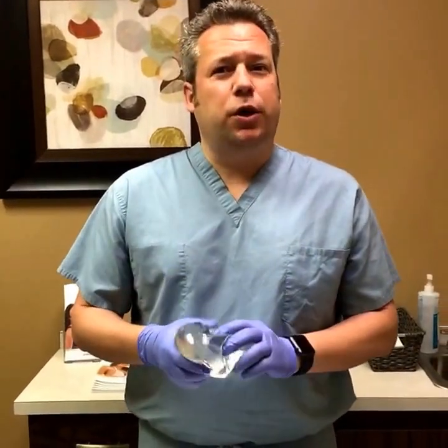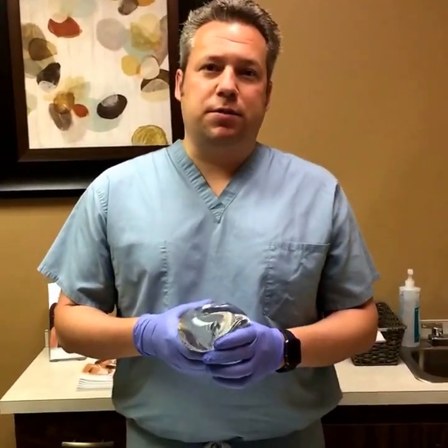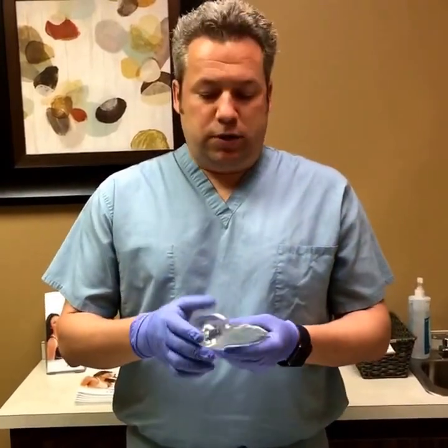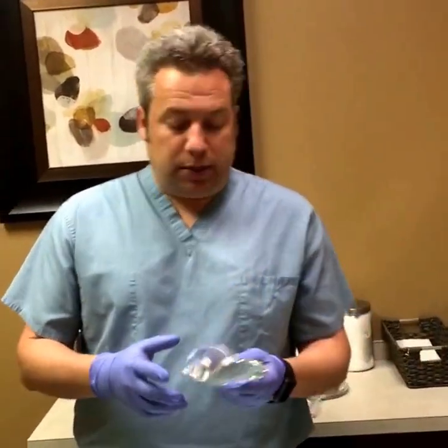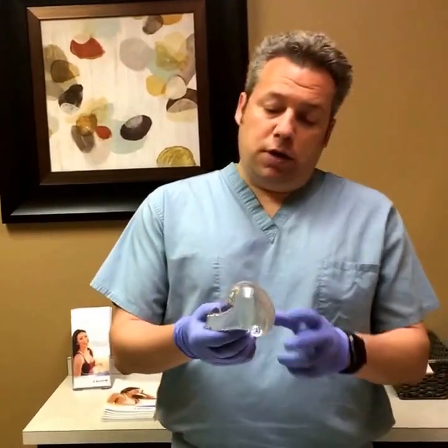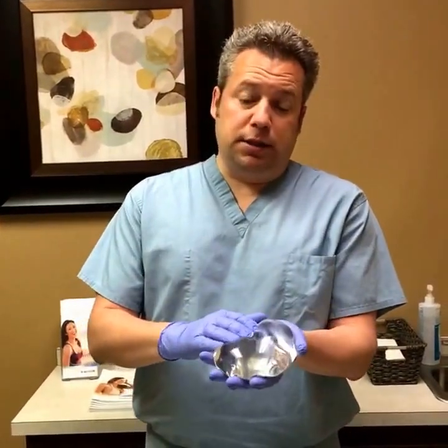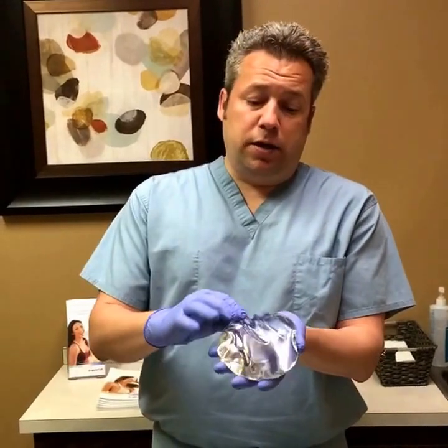I put a post up a week or two ago talking about the different types of breast implants, the safety of those implants, and what really is inside one of these silicone gel implants. So a quick review — what I'm holding here is a Mentor breast implant. That's the brand I typically use and it is a silicone gel implant.